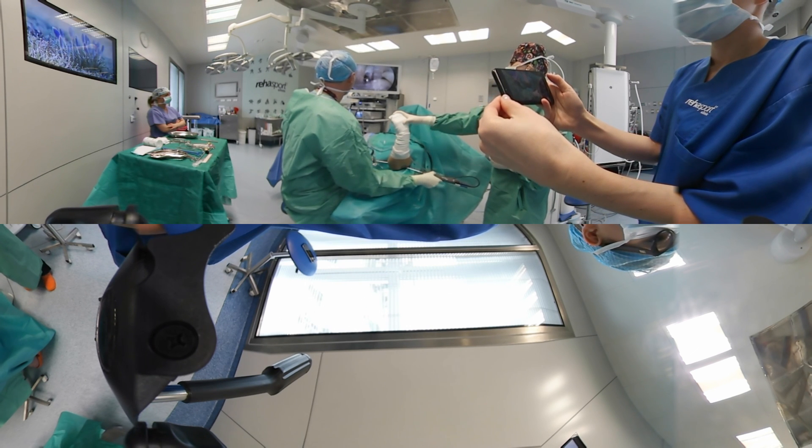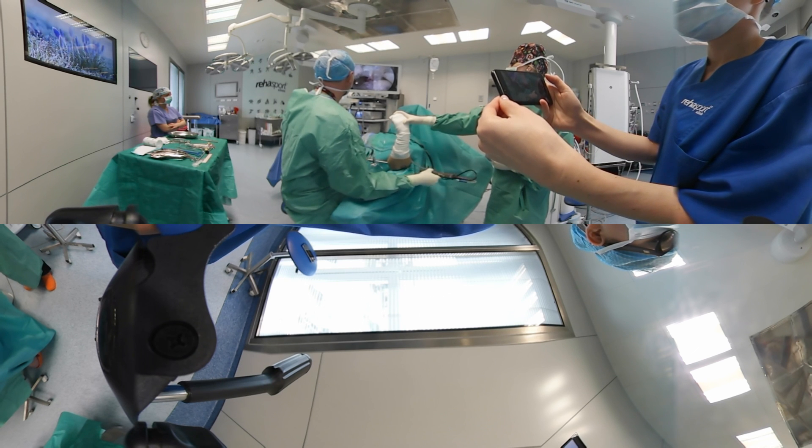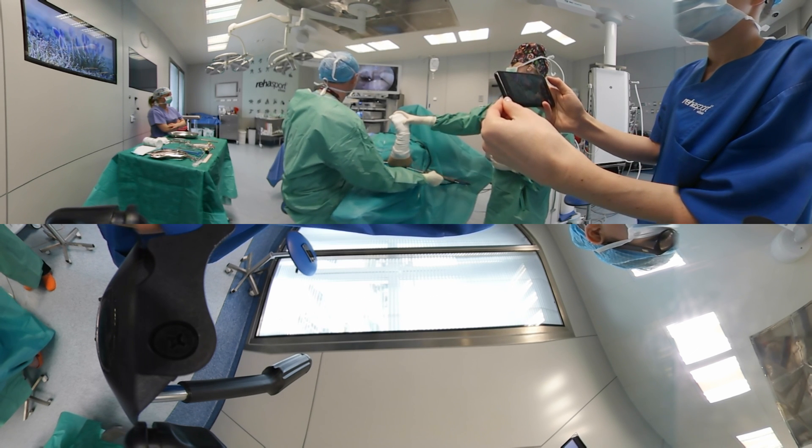After thorough evaluation of the joint, the anterior part of the capsule is removed with the shaver to expose the ECRB and EDC origin.